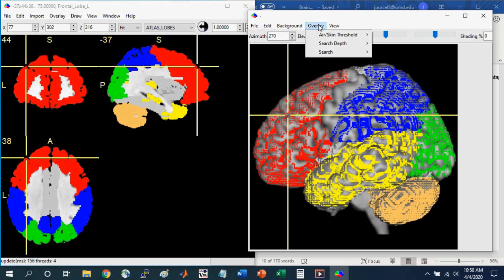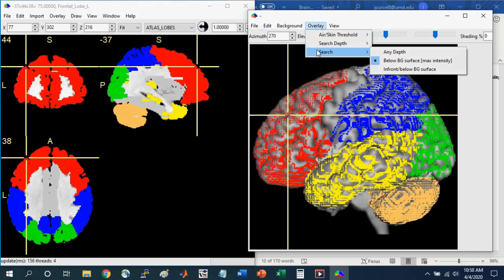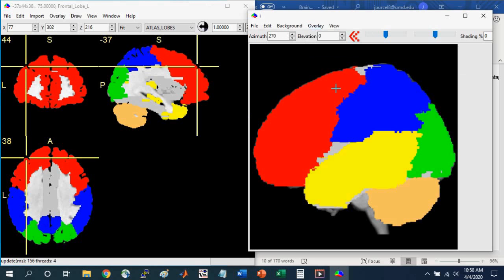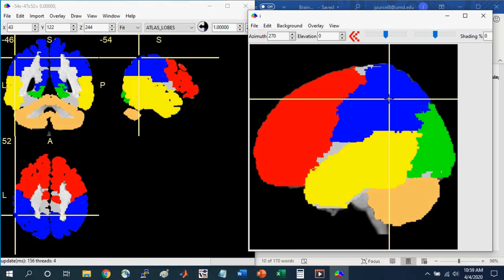If you want to make it a little clearer on this rendered view, you can go to Overlay, Search, Any Depth. And here it will just fill in these colors at any depth through the brain. Whereas previously it was searching only 16 millimeters deep inside of the brain. So this left profile view of a 3D brain is something you might see in textbooks and it might help you to understand how these structures in the slice view match onto the 3D brain. So if I left click here in the parietal, you can see how this point on the surface matches to this point on the slices.